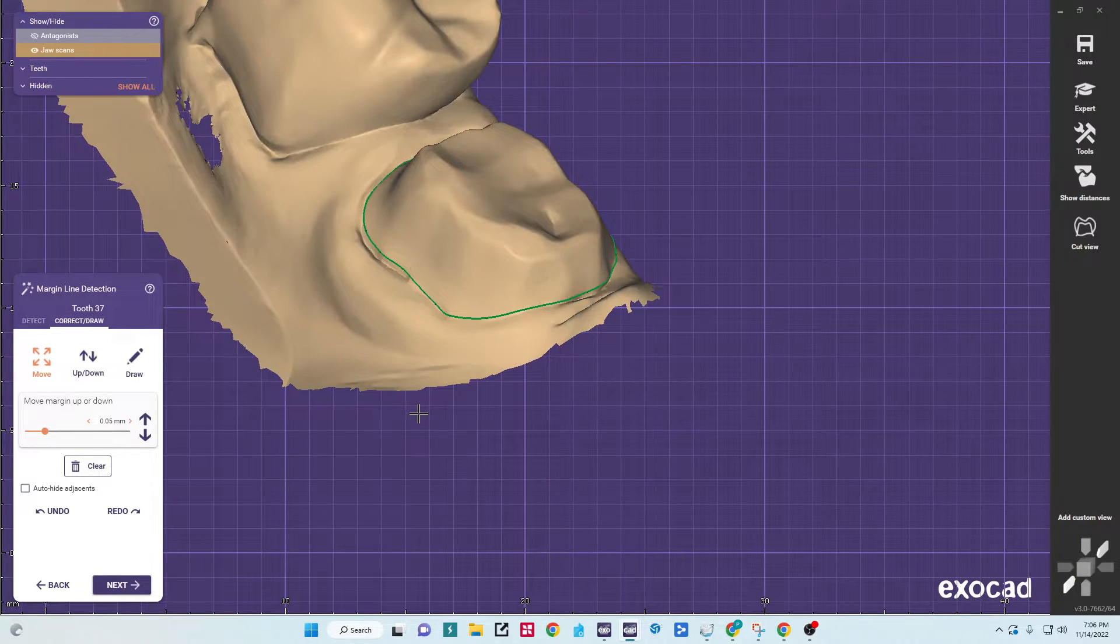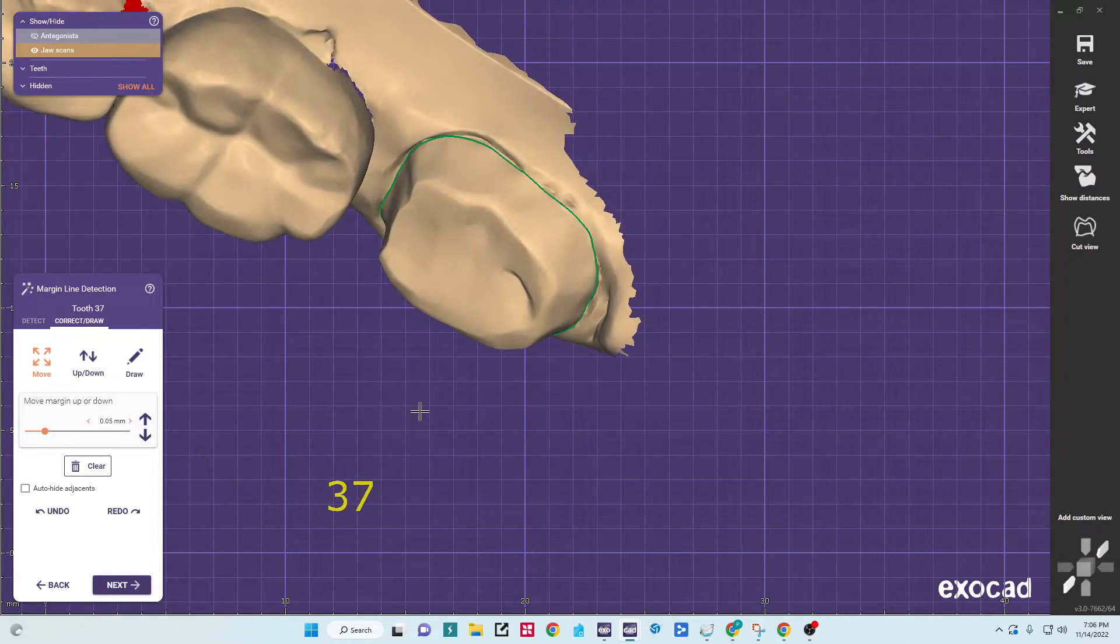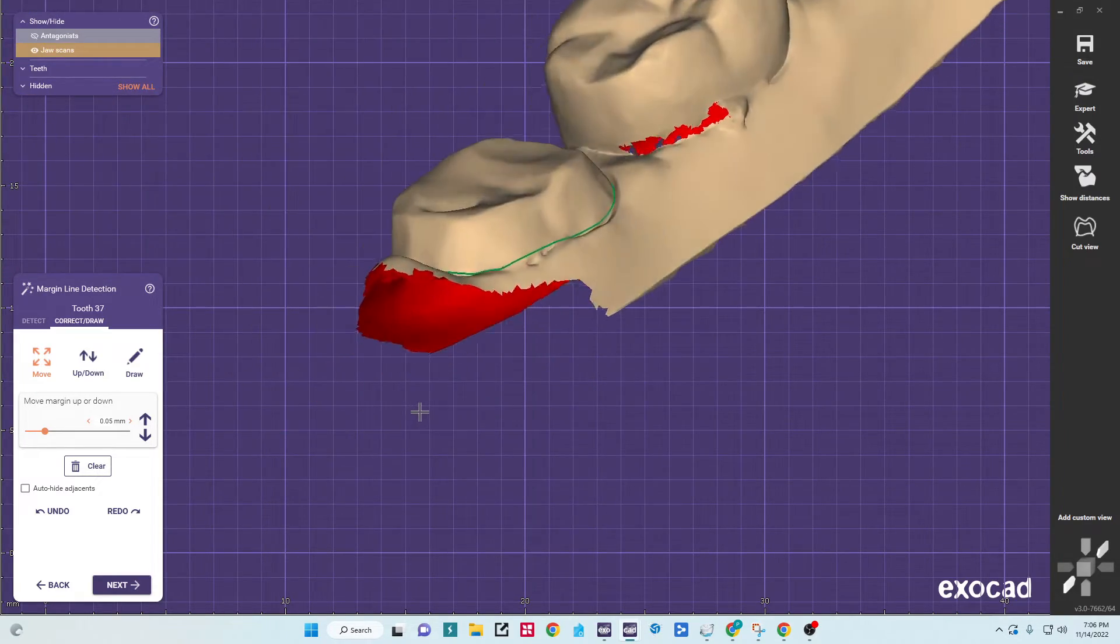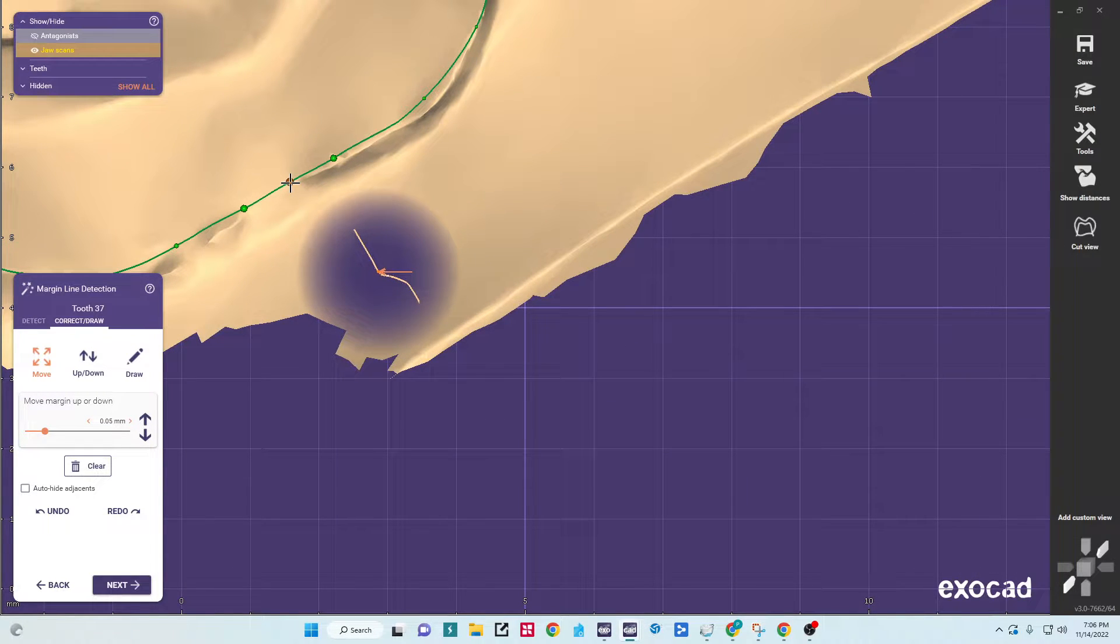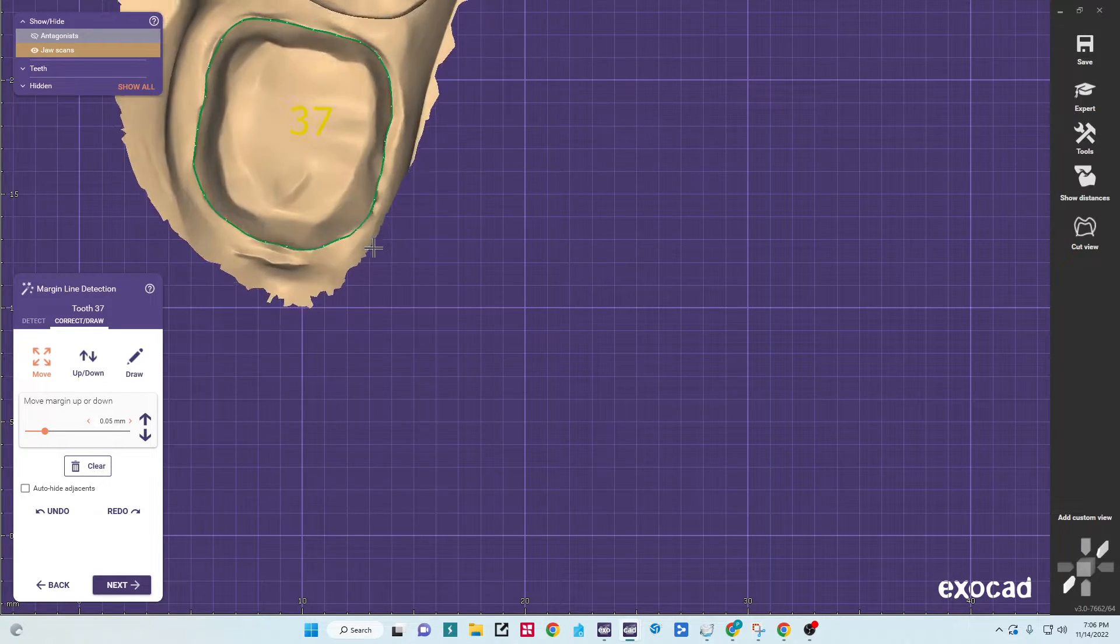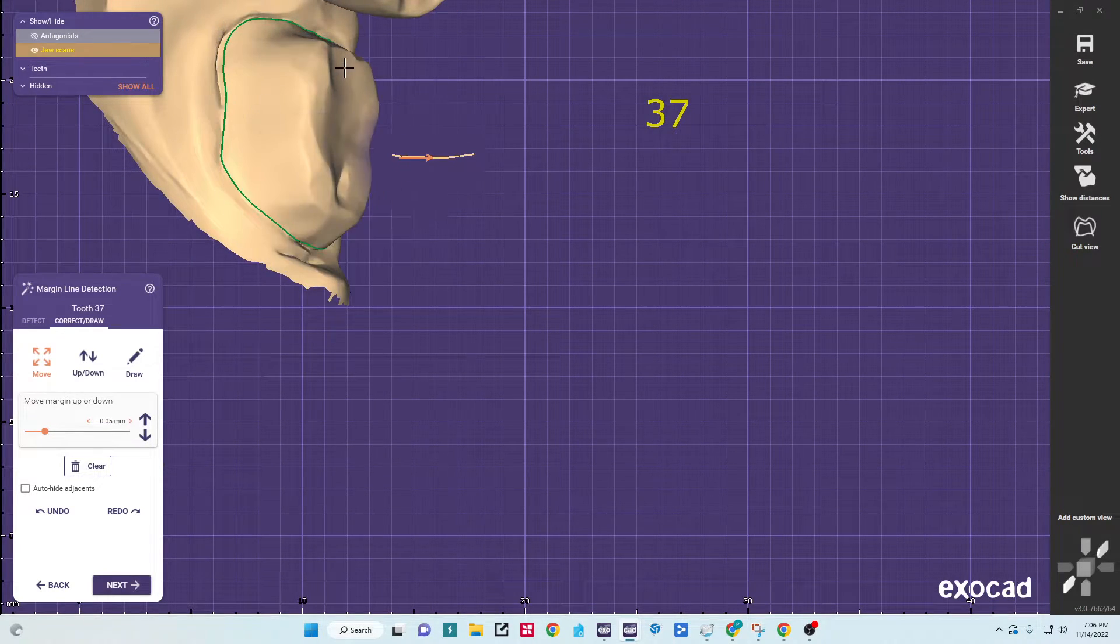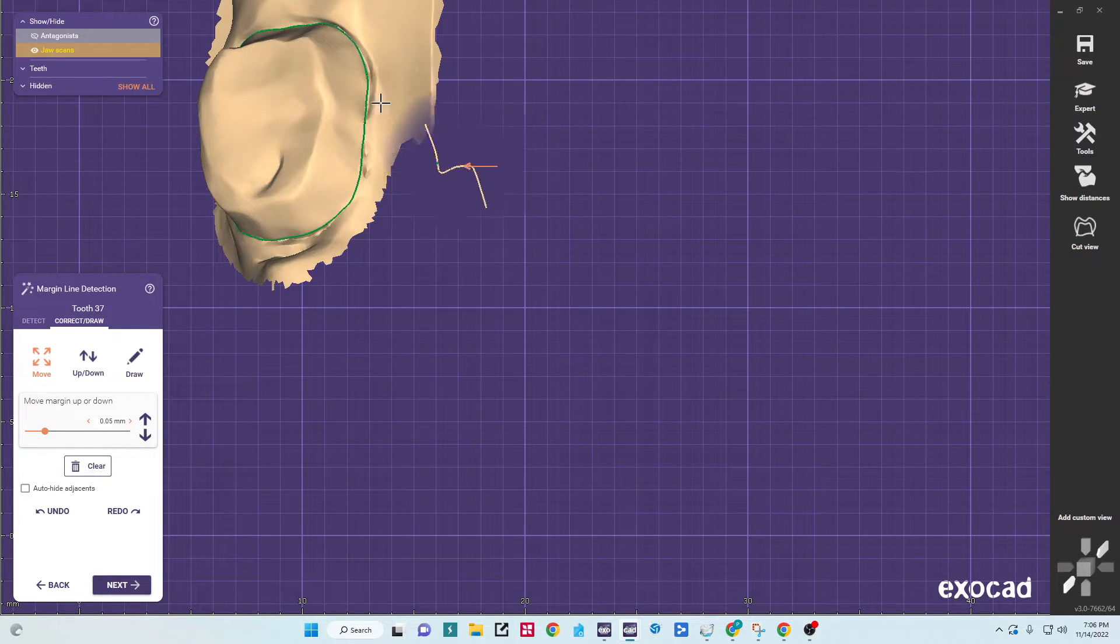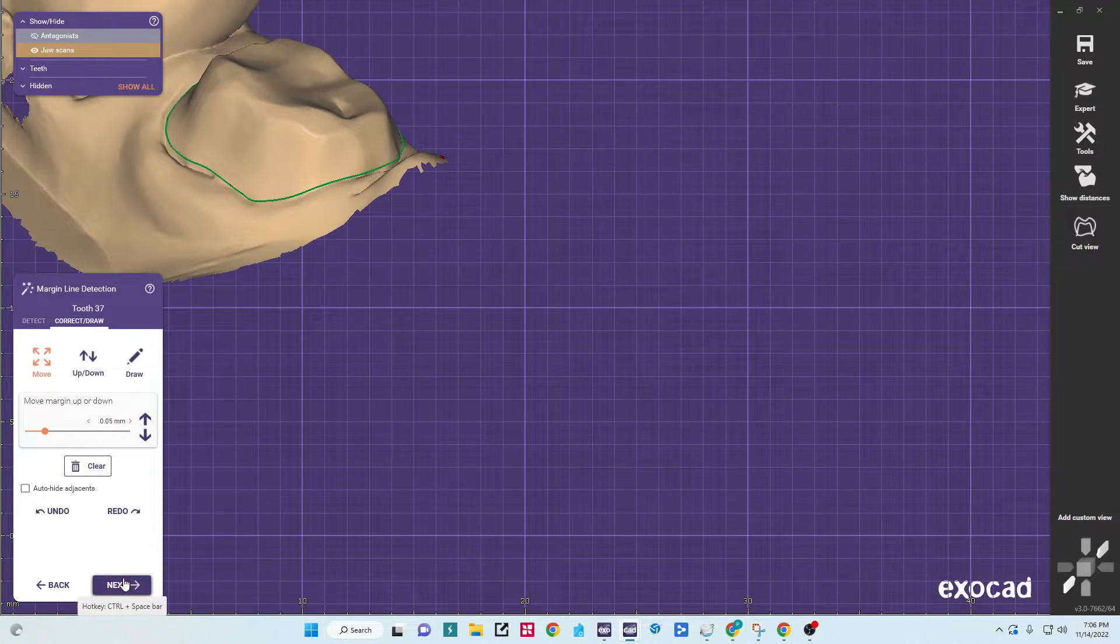Sometimes when you get in too close, it's hard to tell. That looks pretty good. From what I can tell, there's just one abrupt spot right here. I'll fix that. That looks good to me now. This area here is flash where it was subgingival, same thing here. So we'll hit next now.